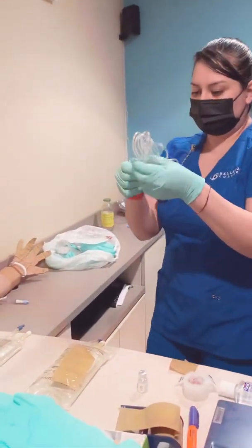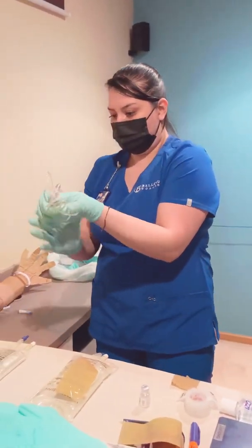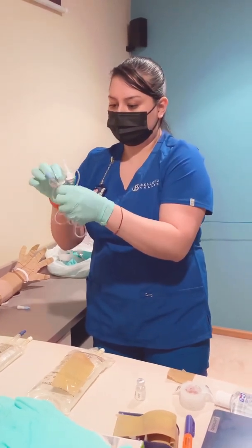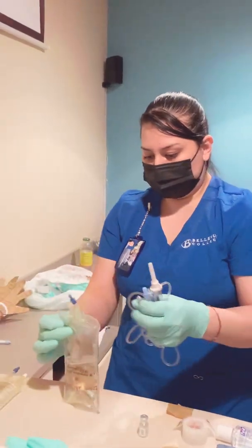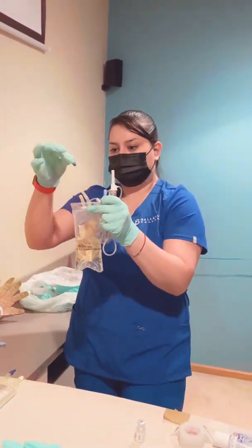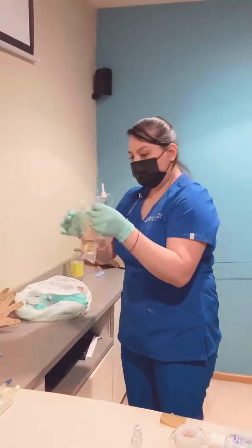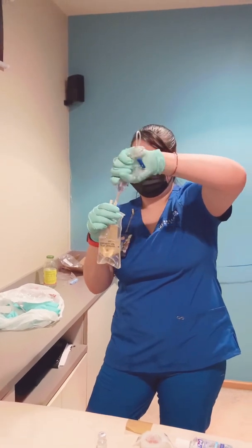And I'm going to clamp to avoid spillage. I'm going to keep everything single-handed here. I'm going to then remove the rubber and remove the cap and keep a sterile technique here.